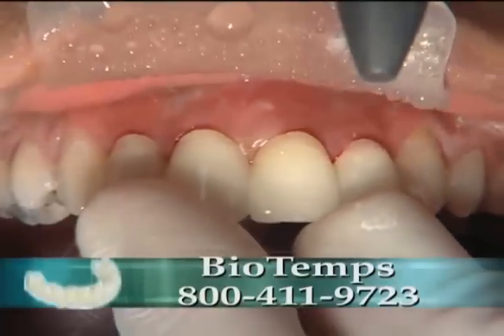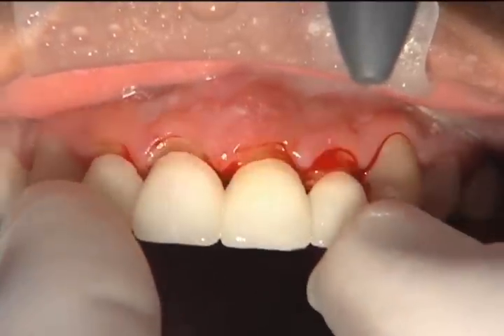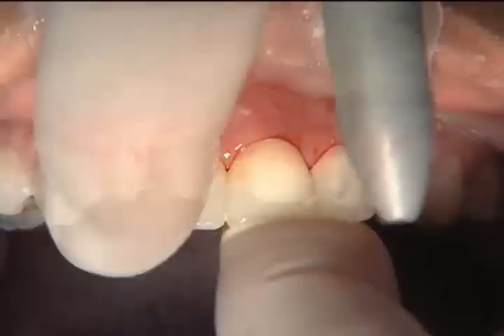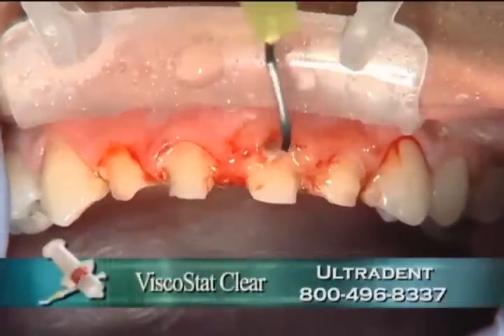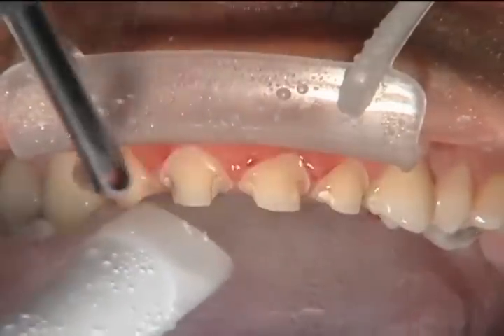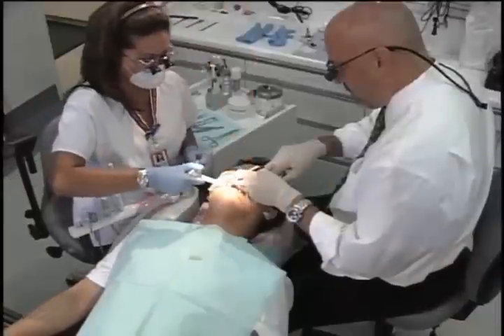I'm trying the BioTemps on right here because they've fixed the gingival levels — they have ideal gingival levels built in. When I push the BioTemps into place, anywhere they're covering the gingival tissue, I know I need to reduce that tissue to get the gingiva to the right level. We're using a little Viscostat from Ultradent to stop some bleeding so I can see more easily. We knew we were going in with the laser to re-contour, so we'll go ahead and do that now.